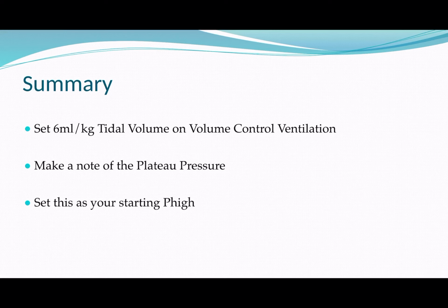You increase the pressure on the good lung, and so all of the blood then rushes into the side that's collapsed, which has got a lower pressure, because blood is silly, it's not clever, it'll just go the path of least resistance.